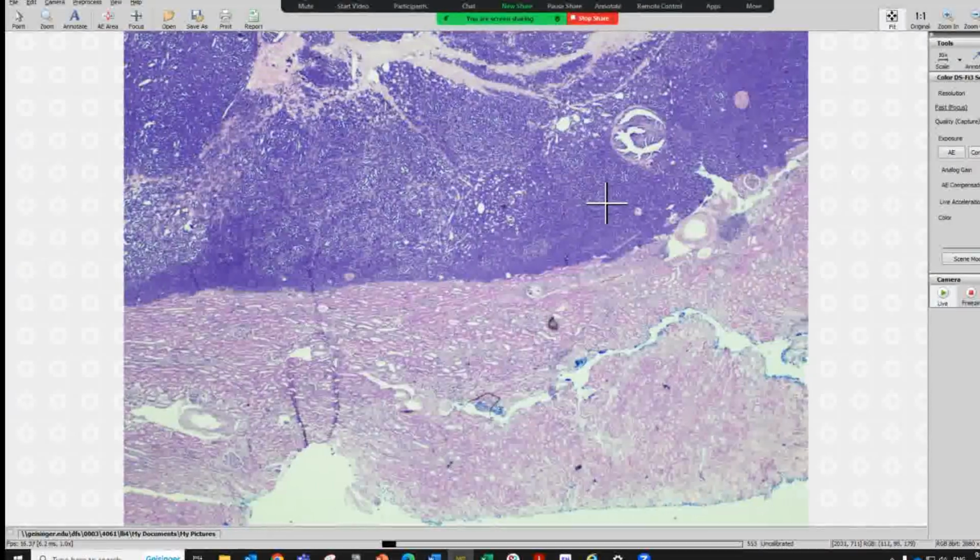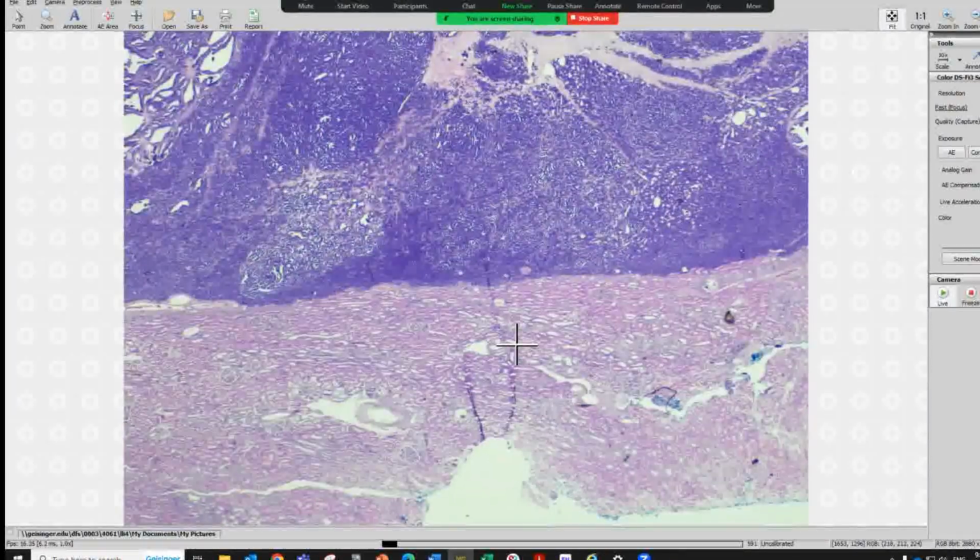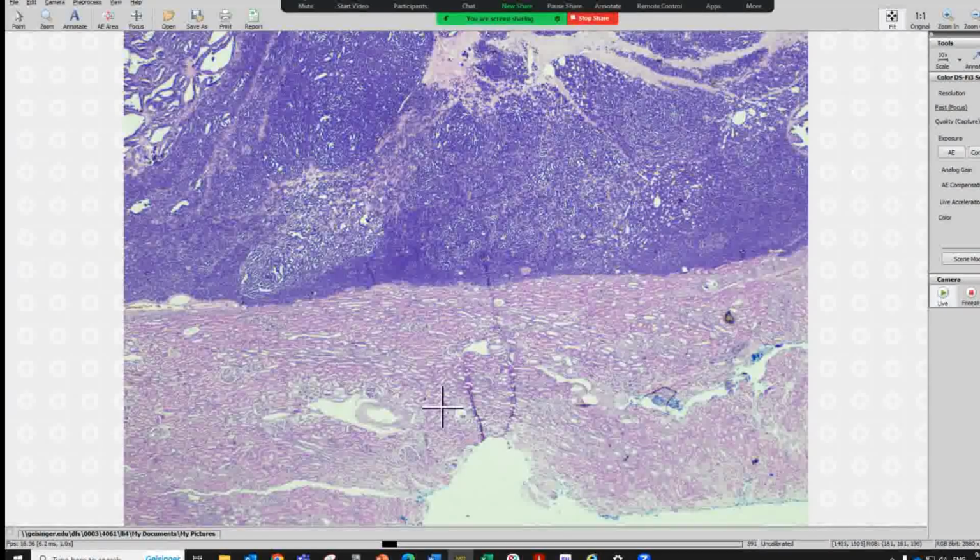For this slide, we have a really nice normal kidney. If I didn't tell you the history, you might say the glomeruli should be normal size, but because I'm sharing the screen, you see less area of my scope. One of our attendings told us that to determine whether a glomerulus is from an adult or from a kid or baby, go to 40x.